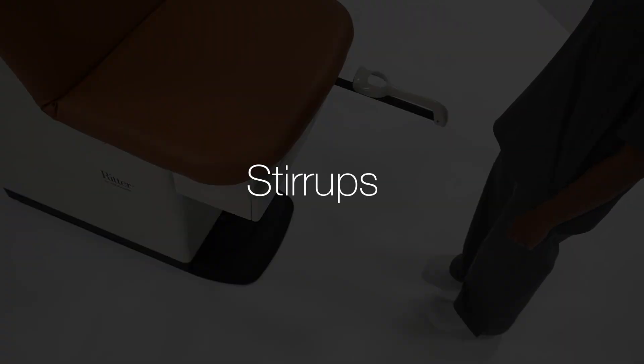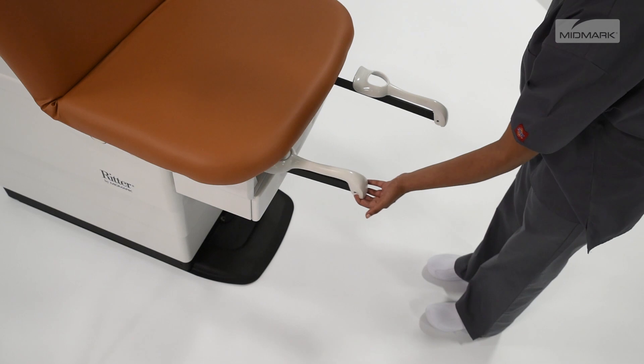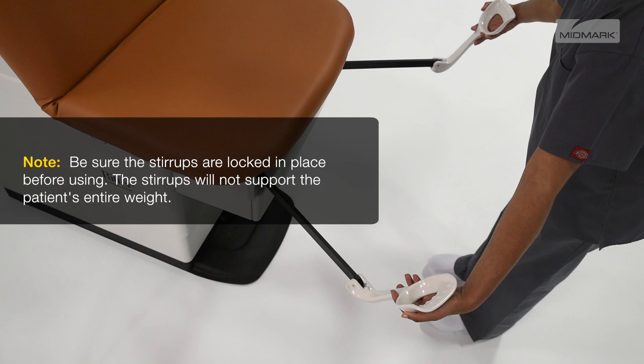To position the chair stirrups, pull the stirrup out, then unfold. Lift the stirrup slightly, move it left or right as desired, and release the stirrup to lock in position.